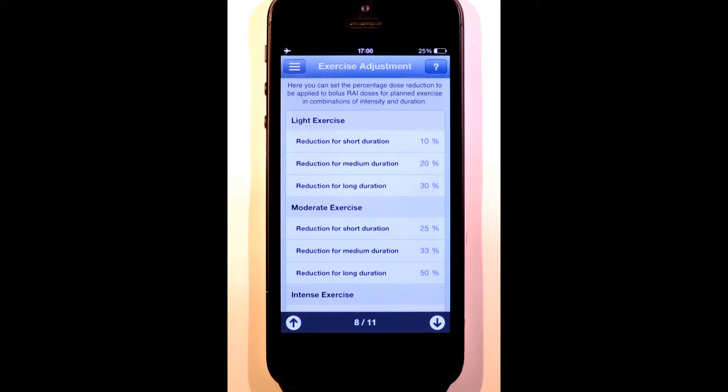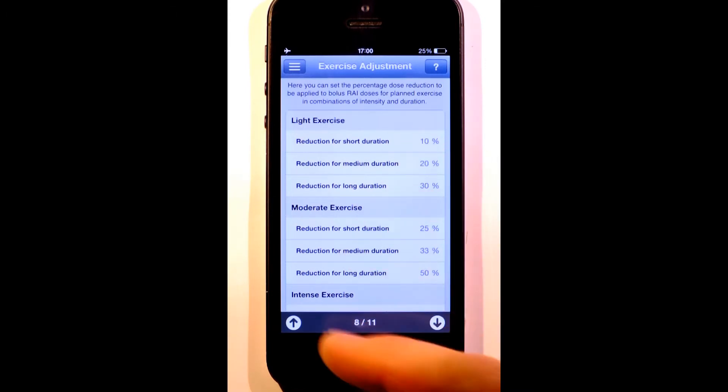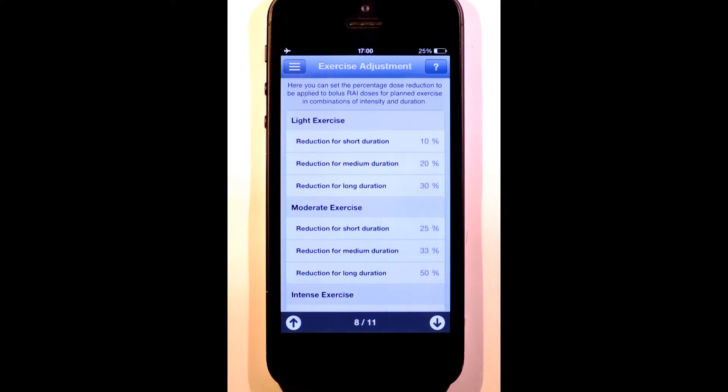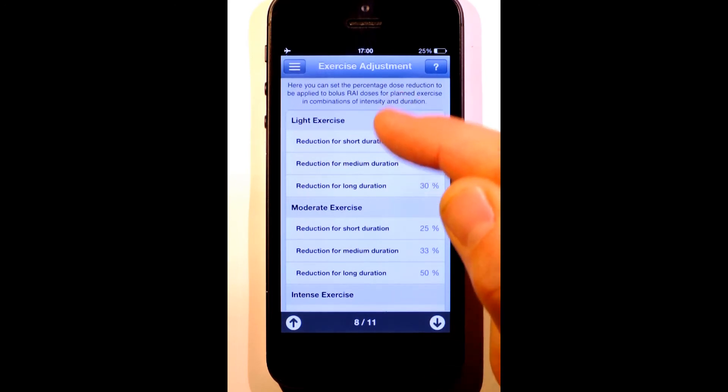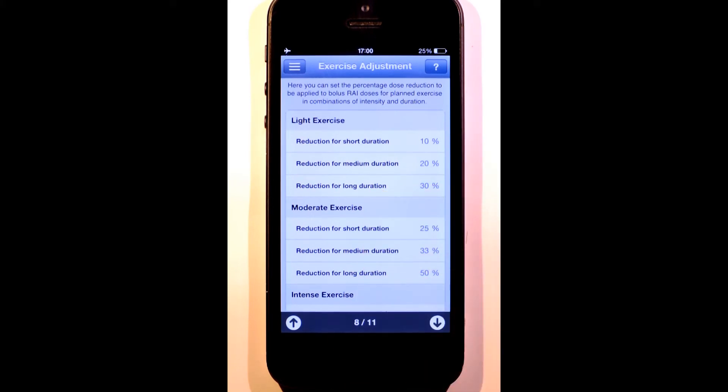Any form of physical activity will reduce your blood glucose level at a rate depending on the duration of the activity and how strenuous it is. This requires a reduction in your insulin dose to compensate. On this page, you tell RapidCalc how much you want to reduce the dose by for different combinations of intensity and the duration of the exercise.